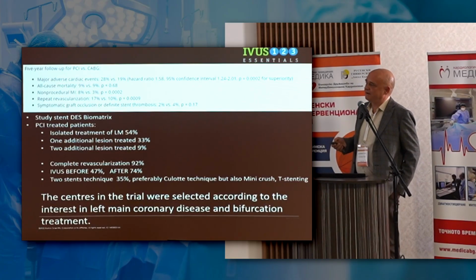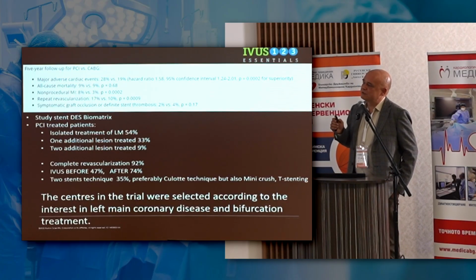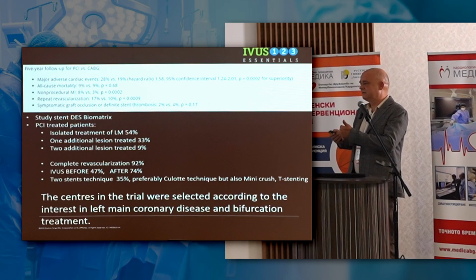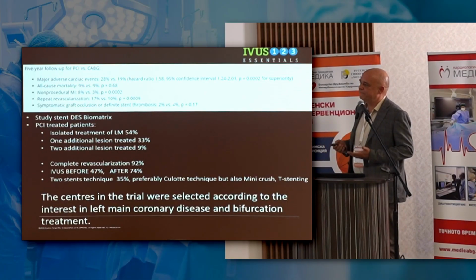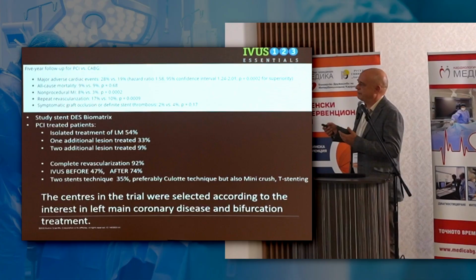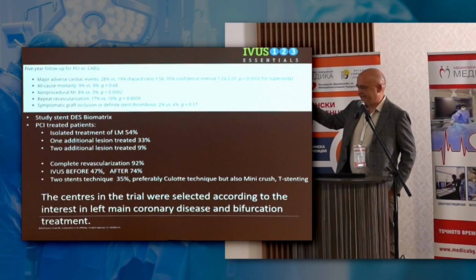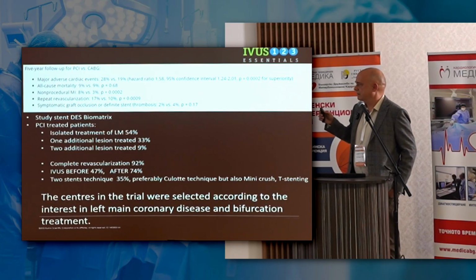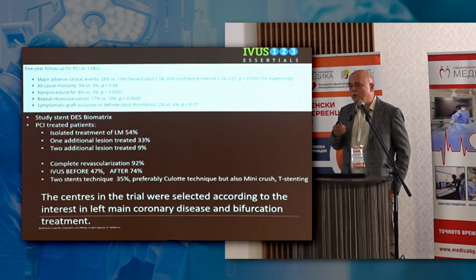So in complex calcified lesions, when you perform IVUS post, you don't have the possibility to use IVL or a cutting balloon. And if you have good information pre to plan your strategy, I must recommend IVUS pre and IVUS post.